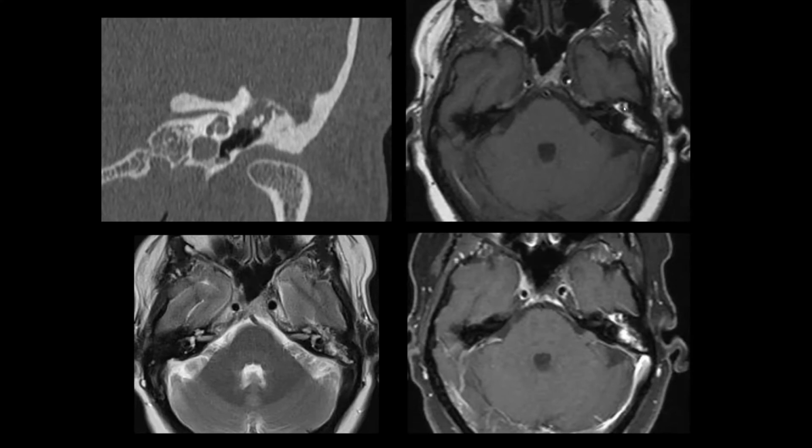the epitympanum here. You can actually see the ossicles here. The aditus ad antrum is here. This is the mastoid antrum. So you can see all of that is diffusely filled with T1 hyperintense signal, no superimposed enhancement. This was a cholesterol granuloma of the left middle ear and mastoid antrum.